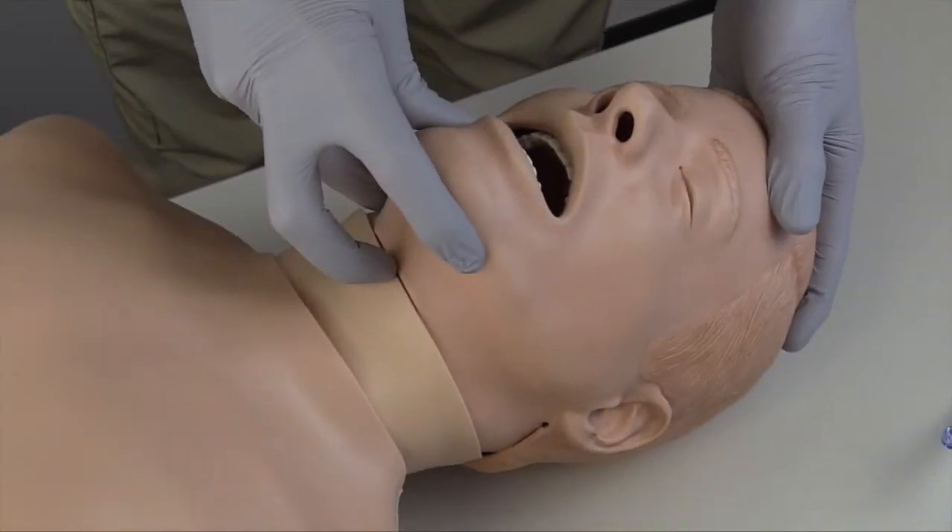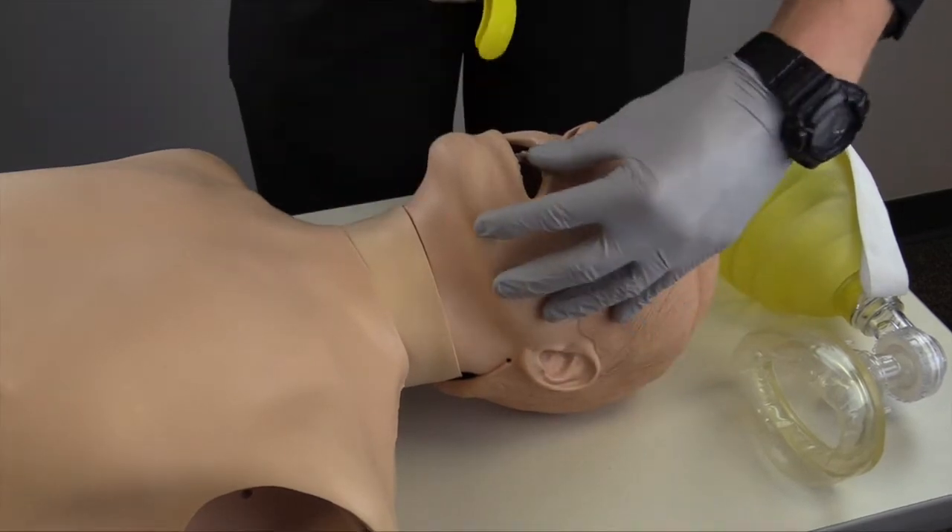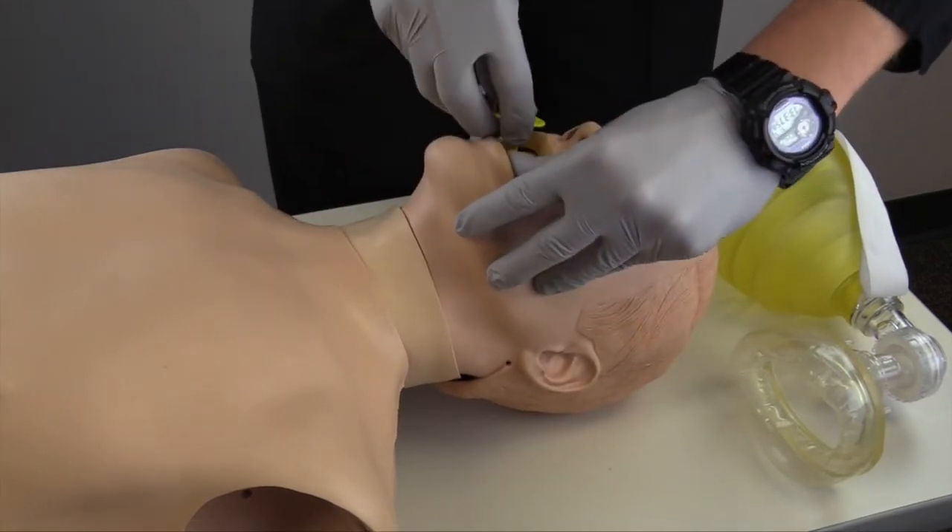I will begin by opening the airway and ensuring the airway is clear of obstructions that would require suctioning. I will then insert an airway adjunct such as the oropharyngeal airway or the nasopharyngeal airway and ensure the patient accepts the adjunct.